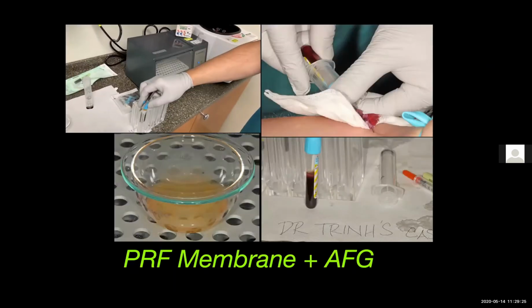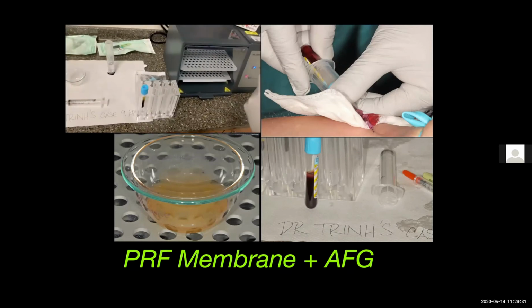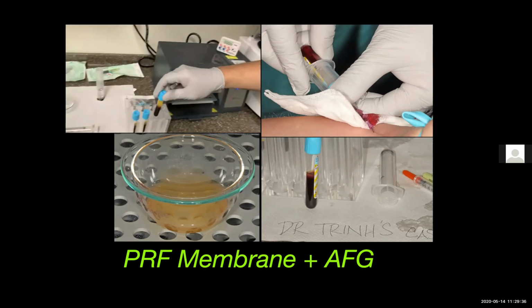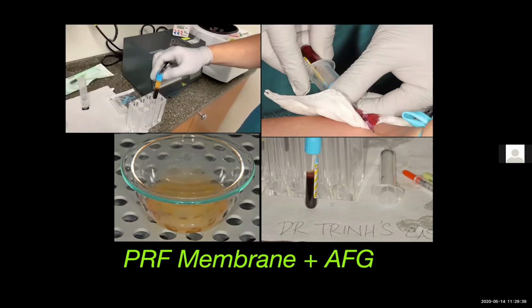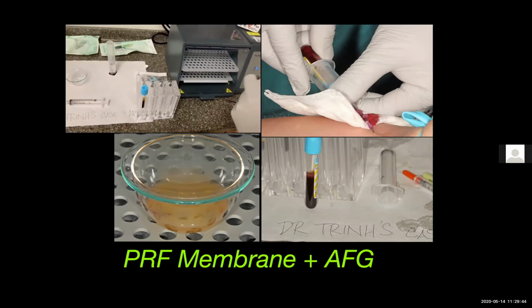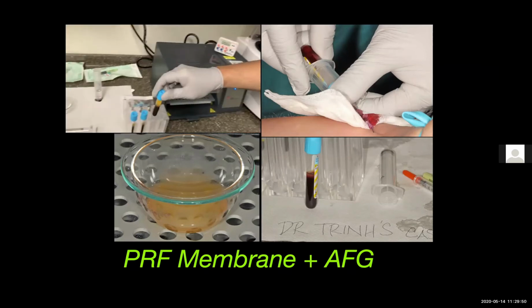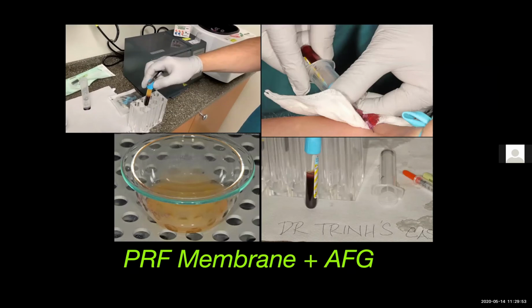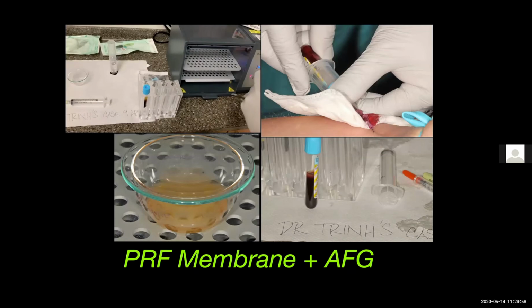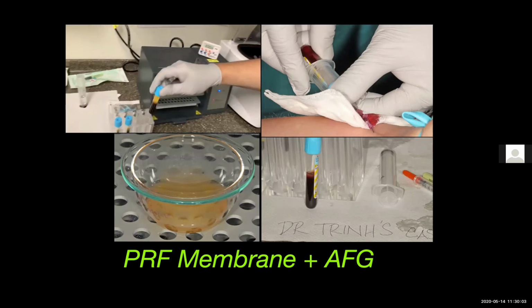Okay, so you saw in the video, I placed a collagen resorbable membrane barrier, right? For this patient, because I have primary stability with more than 30 Newton centimeters of torque, I could easily fabricate an immediate provisional, but the patient chose not to have it. The reason was finance. If an immediate provisional was selected, then it would not be necessary to use the resorbable membrane for graft containment. We can just easily contain the graft with our healing abutments. With that being said, I personally prefer to have a provisional that screws onto the implant on the day of the surgery, especially for immediate anterior implants.